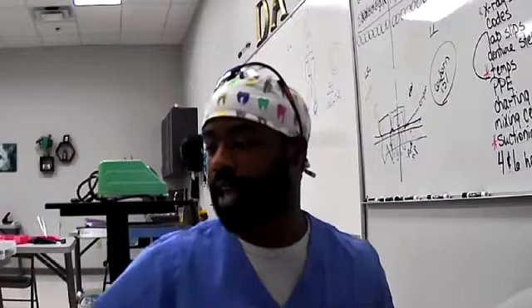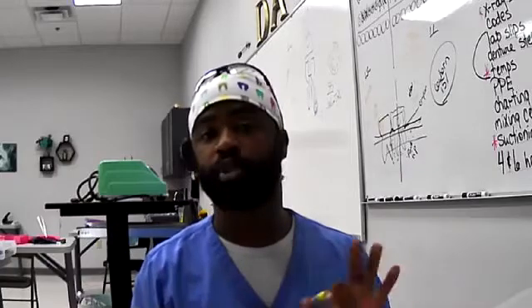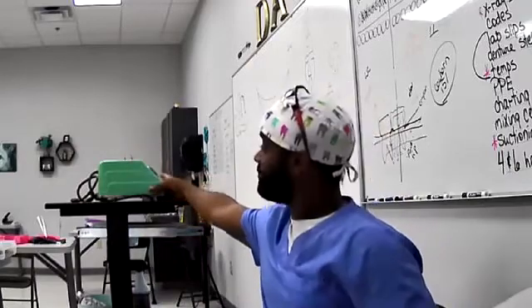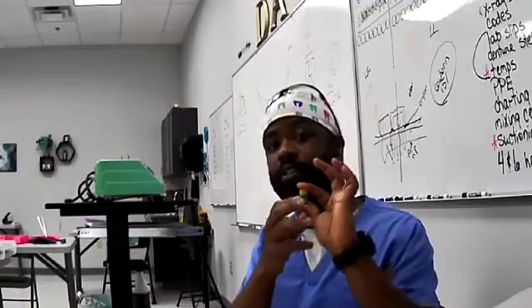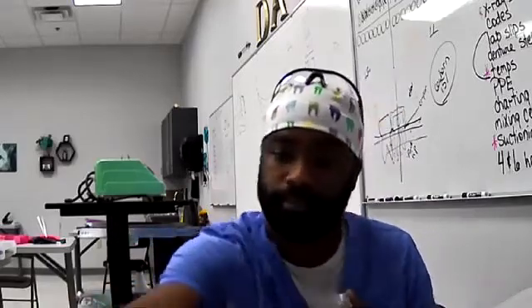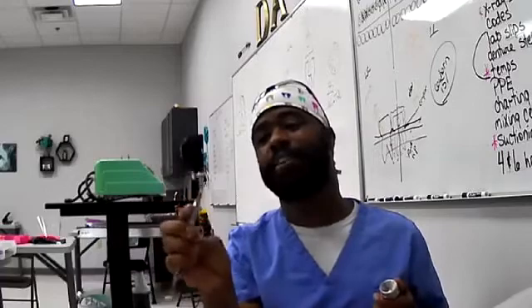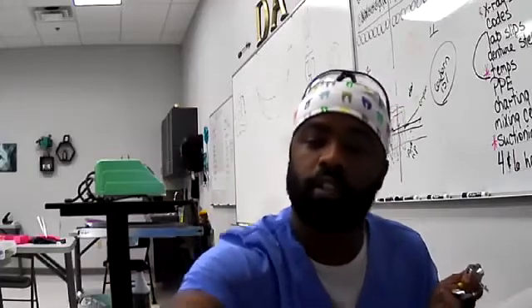Okay, so I'm gonna try to show you some of that real quick. I'm not gonna actually turn on the machine, but I'm gonna show you the basic parts to it. So this is called an amalgamator. We're gonna pretend like this is the newer model. This is what shakes up this capsule of powder to make the amalgam for the amalgam filling. So in order to do the amalgam filling, you will need your amalgam carrier, packer, cleoid-discoid.